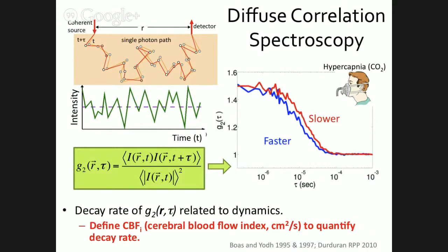So then moving on to diffuse correlation spectroscopy, which is a nice complementary technique to FDNIRS, which measures blood flow. This technique was developed in the lab at University of Pennsylvania, where I did my PhD, and I spent most of my doctoral work progressing the technique and starting to validate it in humans.